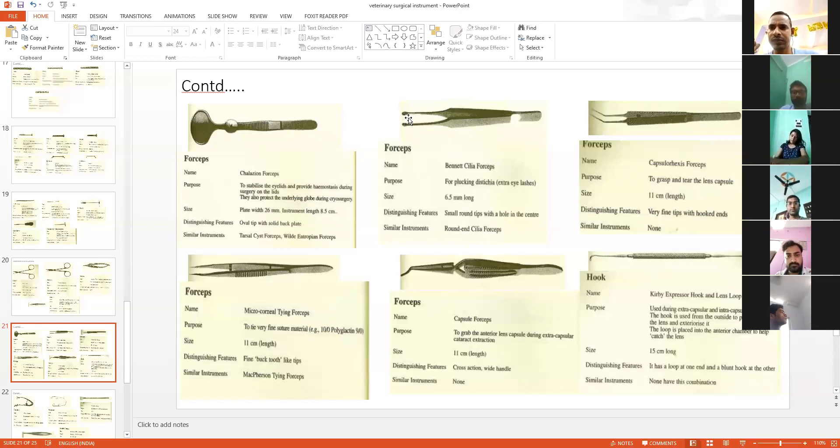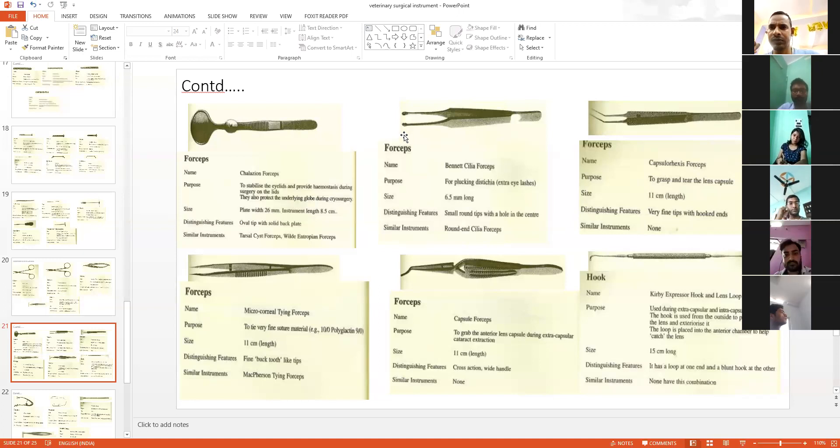You see here, this blunt end is used for the removal of that particular inverted cilia.